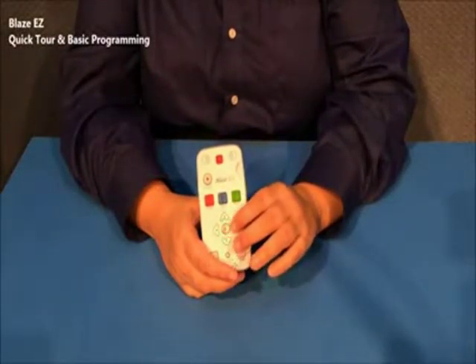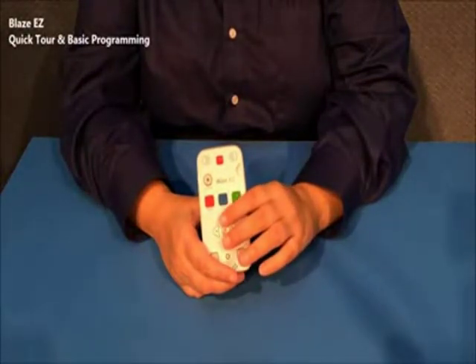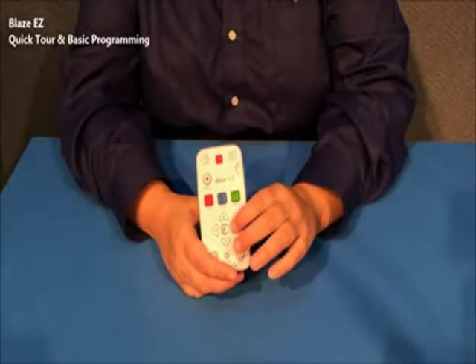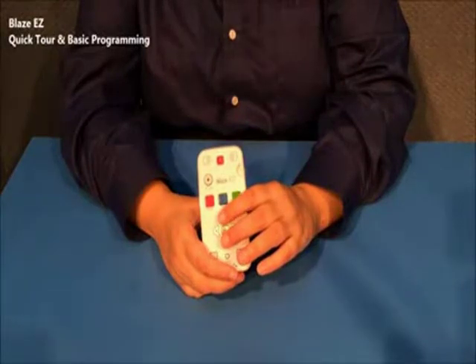And now I'm finally down to a documents folder, which is what I was looking for. Actually, everything in the root of the SD card is shown in a folder called SD card. So if I want to open that, I can press the right arrow. Access at 0914.HTM 1 of 12. Booksman's Quick Start Guide.pdf 2 of 12. So now I have a list of the documents in that folder.